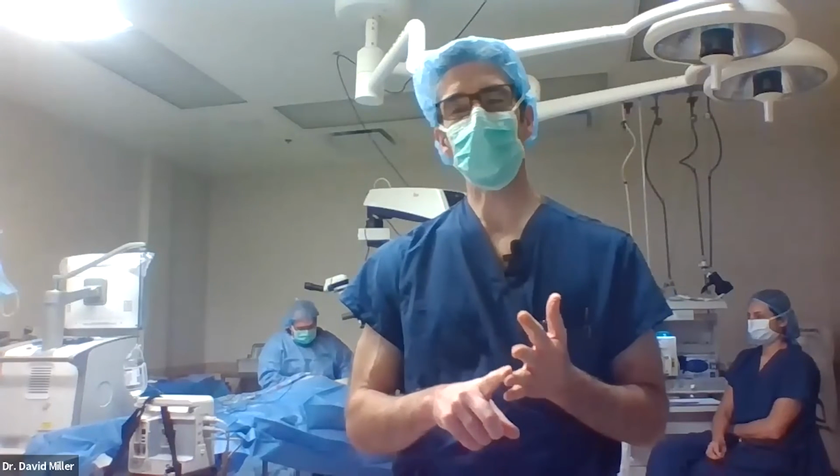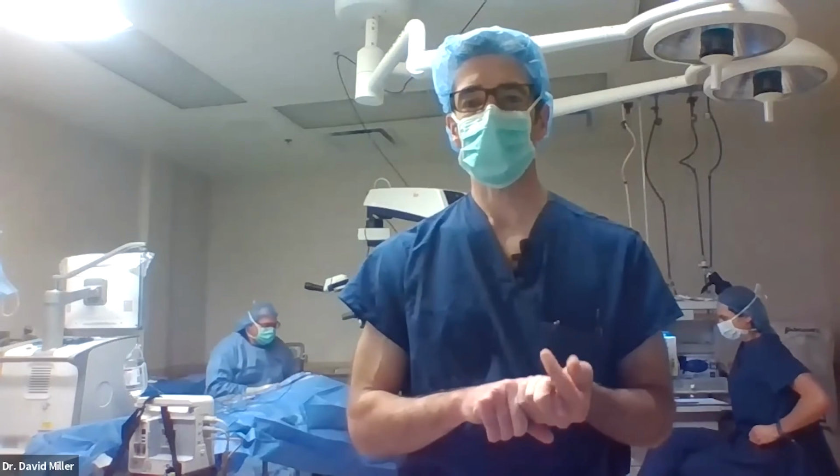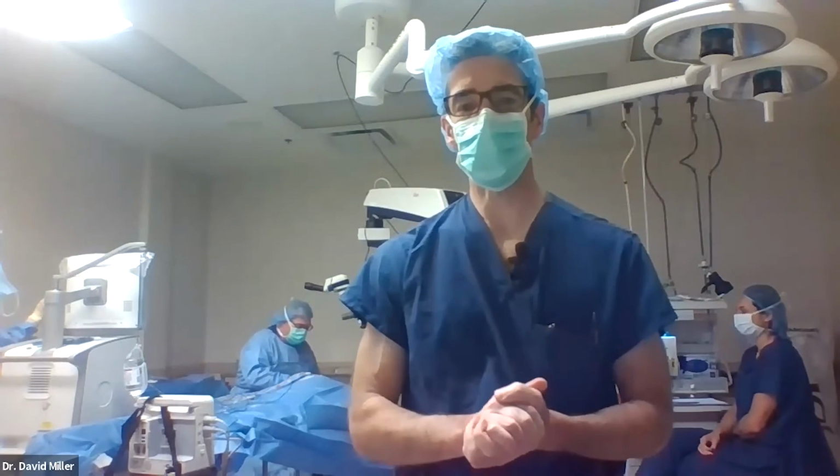And for reproducibility, safety, efficiency, and cost, I think it's very tough to beat a posterior retinotomy, drainage retinotomy. More advanced techniques, certainly there's other ways to do it.